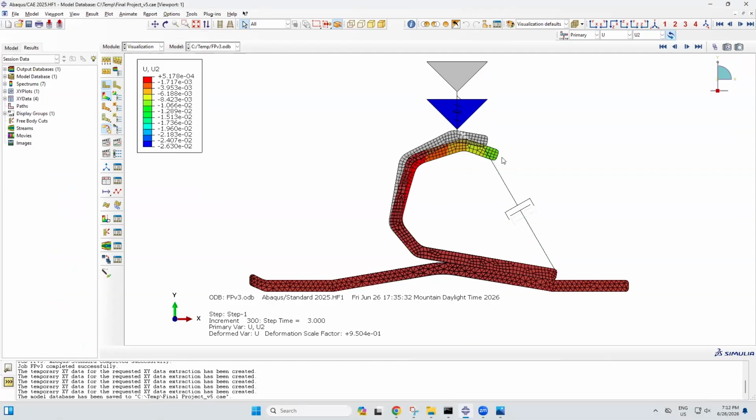You can see how the top part moves to the right while the spring connector moves down, and the spring is somewhat rotated in a way as it is connected to the top plate, and the top plate moves to the right. This is the final deformation, whereas with the oscillations, you will see that it doesn't just go straight there, it goes through a whole process.